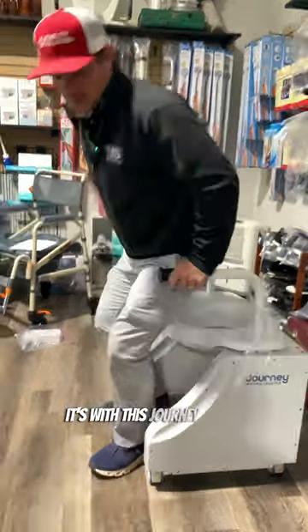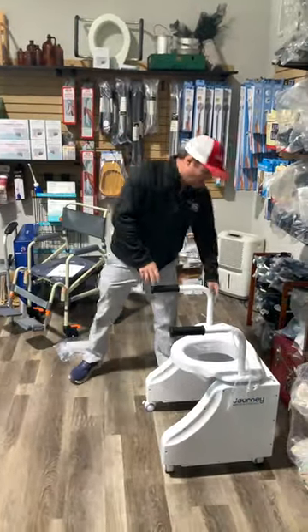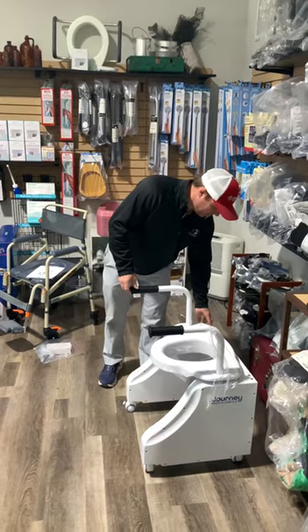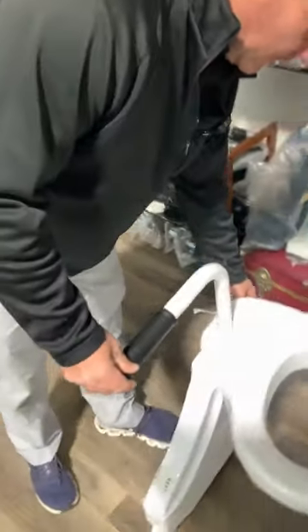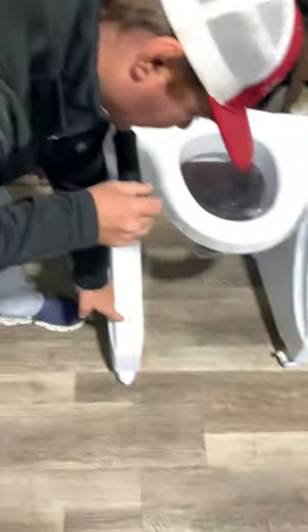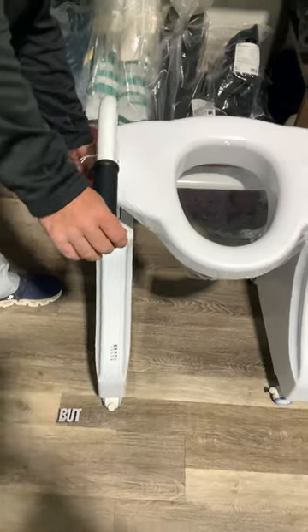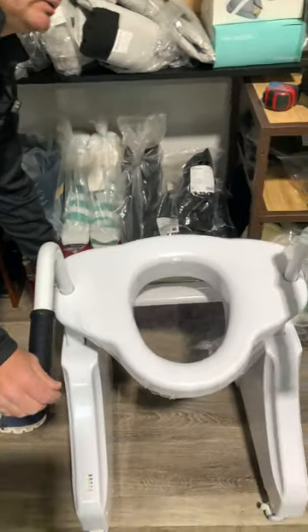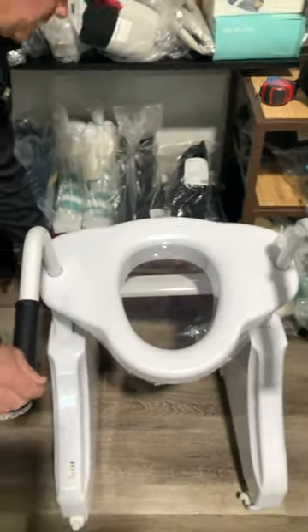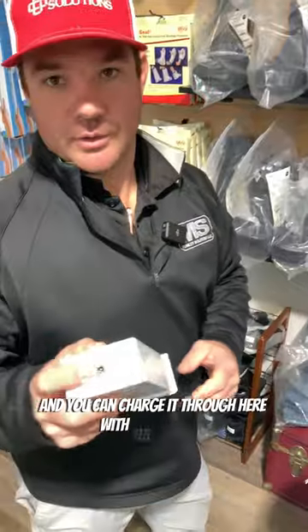It's called the Journey Uplift. Now there are other products — I call one the tilt. Your battery kit is right here, and you'll have plenty of notice when you need to charge it. Pull this up a little bit, and the battery can come out so you can charge it through here with the charger it comes with. It's very light.